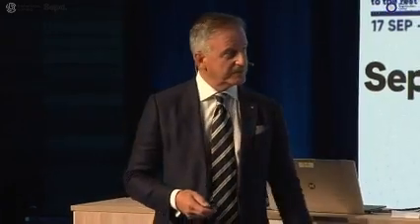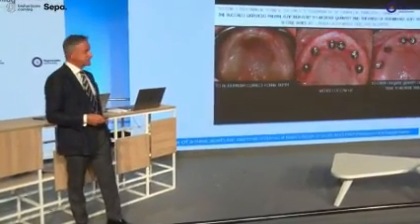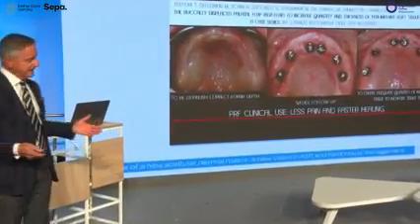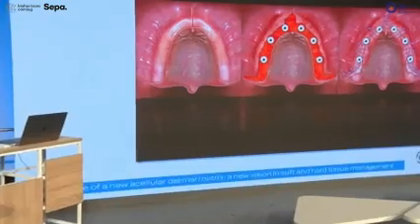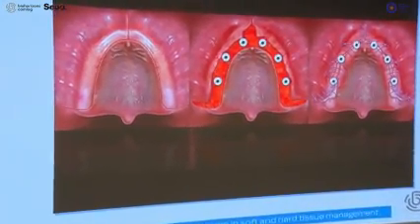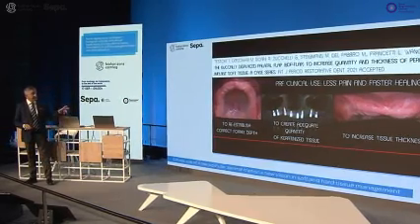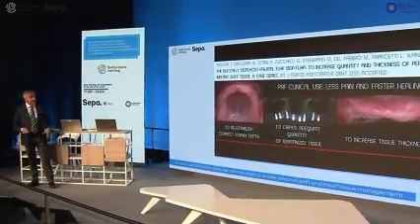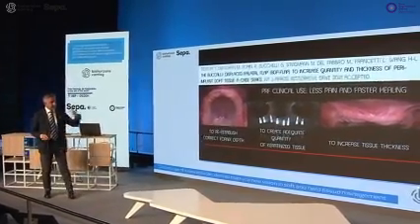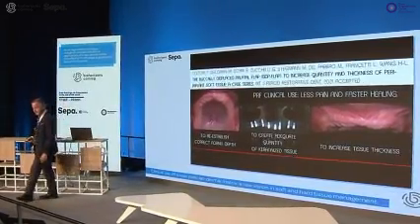This is 1 week follow-up, 2 weeks follow-up, and 3 weeks follow-up, almost healed, completely healed. And this is the type of flap, the drawings taken from our publication. And this is a clinical case in which we see on a regular basis less pain and faster healing if you combine LPRF.